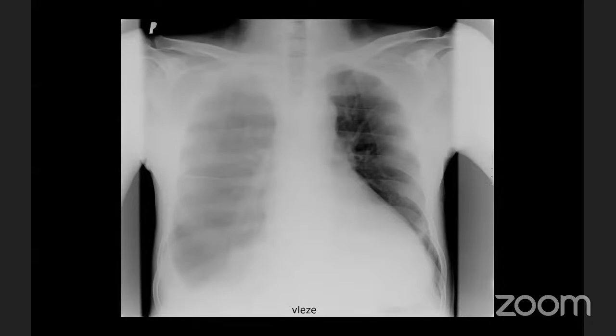So I will start with the lung fields again. If we compare the transparency, the right lung field, there's like an opacified hemithorax. Yes, great. And there is compression, I would say, of the left hemithorax, because the lung field is smaller. The hila are opacified, obviously. In the left, I would say they are concave, and the transparency is a bit more opaque.